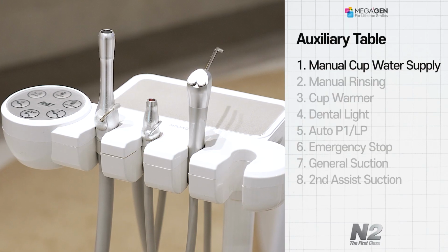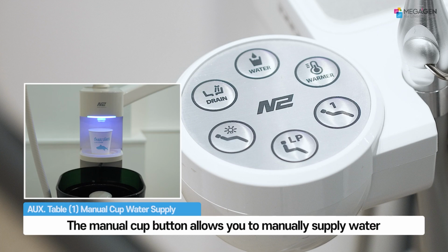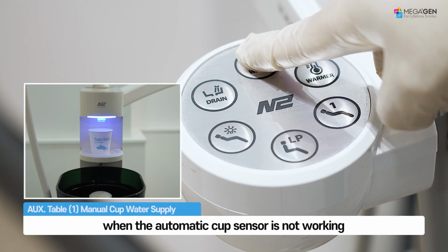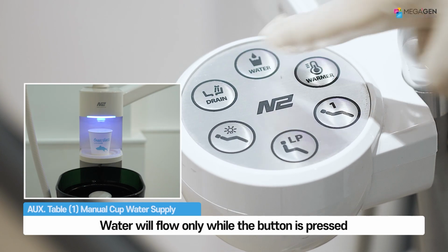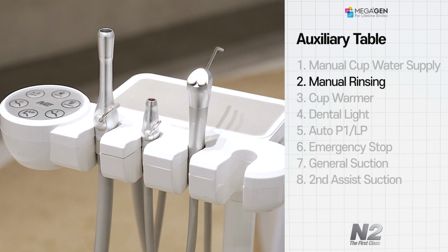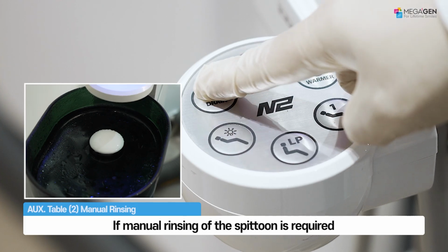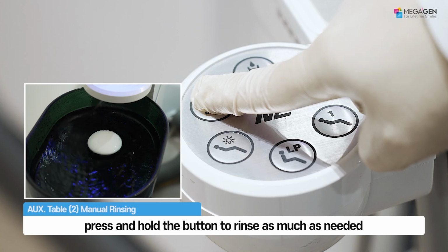How to use the assistant table. Manual cup filling function. The manual cup button allows you to manually supply water when the automatic cup sensor is not working or when additional water is needed. Water will flow only while the button is pressed. Manual spittoon rinsing function. If manual rinsing of the spittoon is required, press and hold the button to rinse as much as needed.